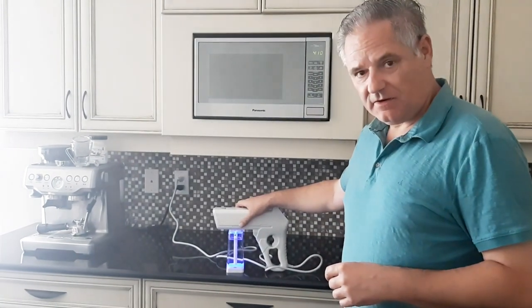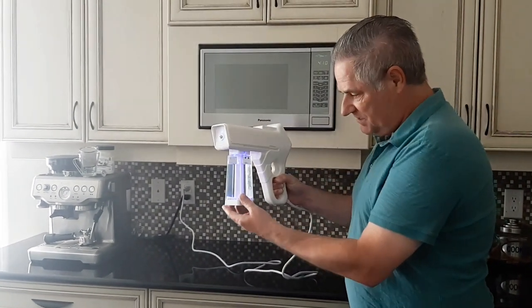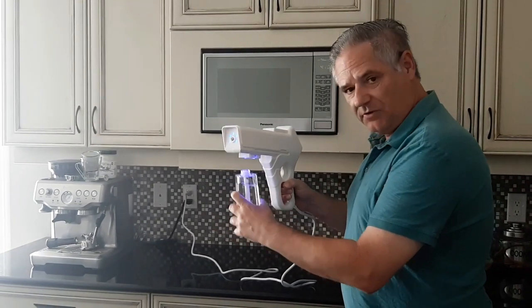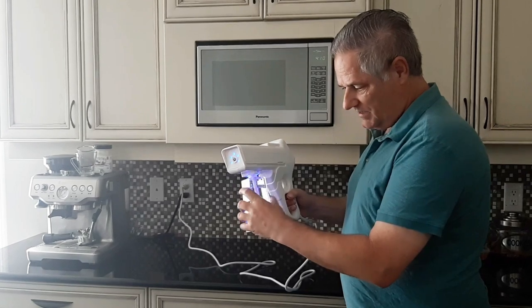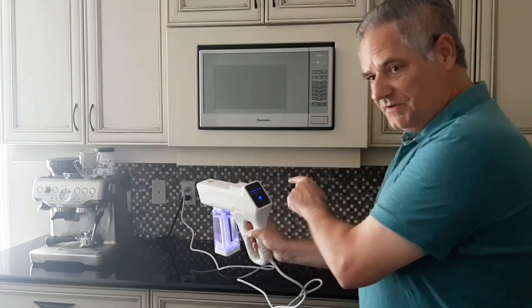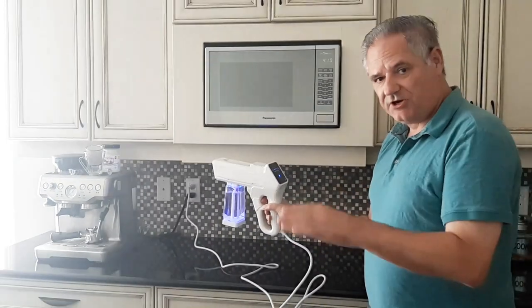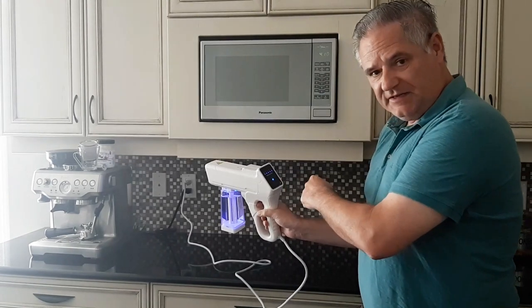This is basically a thermal fogger. What you do with this — you can see you plug it in, you fill this up. This turns off really easy upside down, fill it with disinfectant, put it back in the unit like this, turn it — ready to go. You turn it on, you set it at different levels, give it time to heat up, which is a very short period of time. This means full blast when all the LEDs are on.